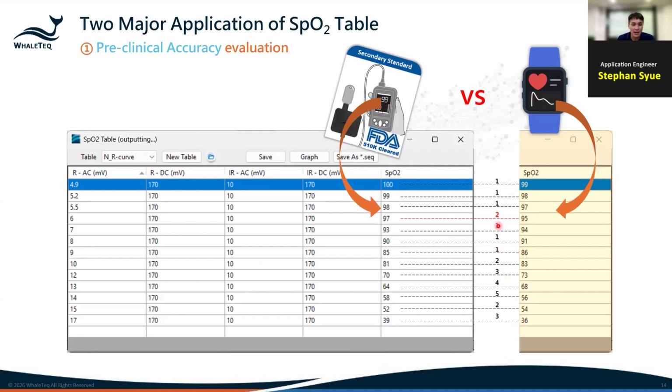So here, for example, I can see the 2% is undesirable, and we can figure out that this is where you can start the investigation on that part. Instead, if they track closely, we have strong engineering confidence going to the clinic. But is there any systematic bias at a particular saturation level? We just found a calibration problem before we are charged for a failed clinical study.